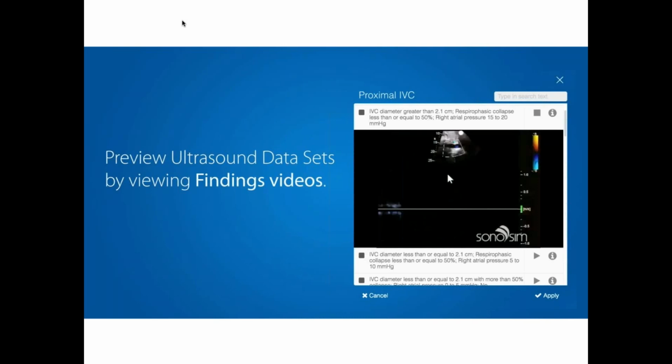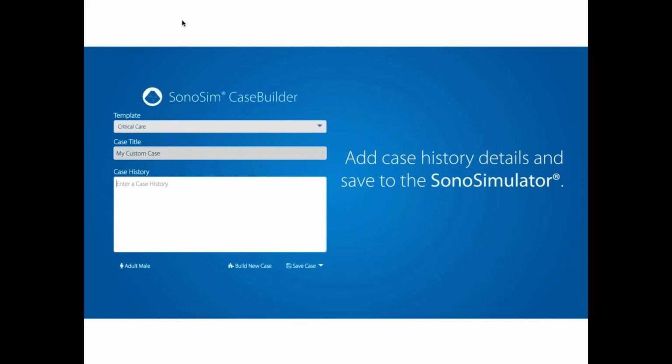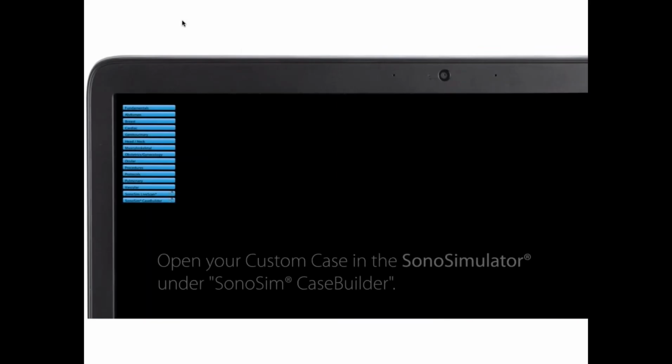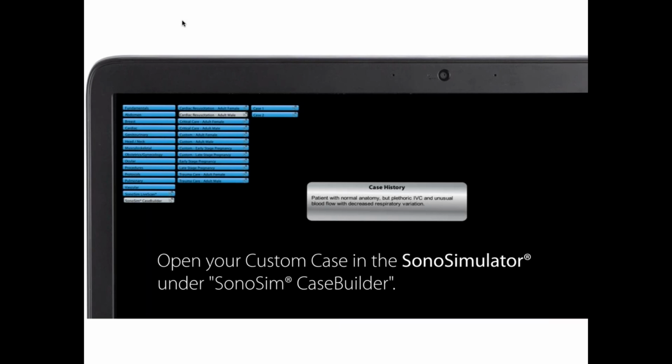You can scroll down through an entire library of all of our data sets for the proximal IVC, and once you find the one that you like, you'll click down there on the right-hand side, apply, and populate that data set. You'll continue to do that until the entire template is populated, write your case history, and then that gets imported into the simulator into a tab called SonoSim Case Builder, you can see over here.